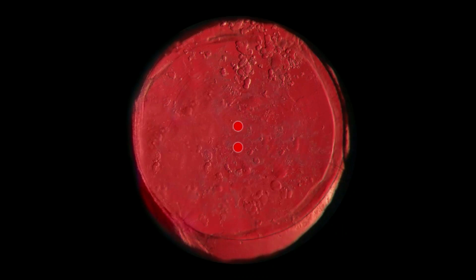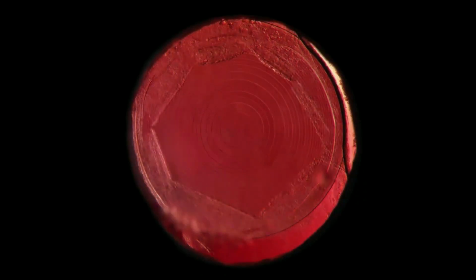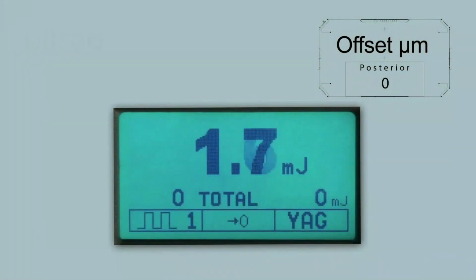An energy level of 2 millijoules should be enough to create an initial opening, and after a few shots we see this intermediate result. The following images were not created in Photoshop, but with the cooperation of this patient, who without complaining moved back and forth several times between the YAG laser and the slit lamp camera, enabling us to capture a photographic record of this real-life situation. I will now show you another photo animation of the procedure, followed by real-life surgery.